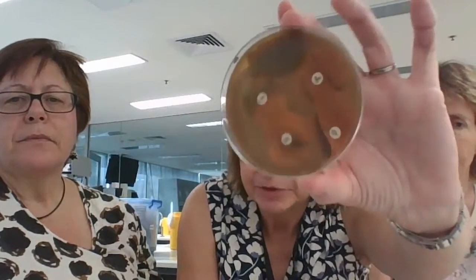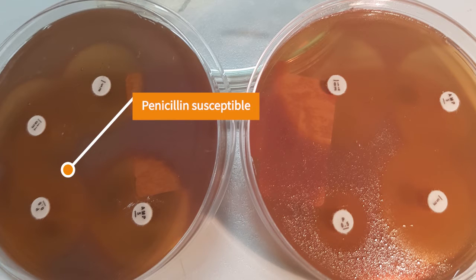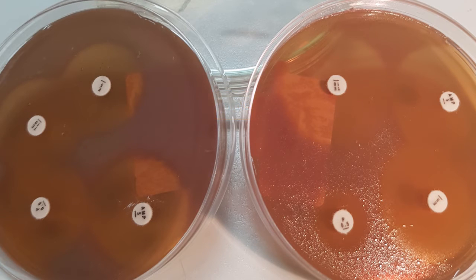So we've got a strep pneumo, and this one is fully sensitive. You can see that there's a zone around those discs, and this one here, one of the discs has got hardly any zone at all. And that's because it's resistant to that particular organism. So it's important to have that information to give to the doctor so that they can treat the patient with the correct antibiotic to effect a cure.